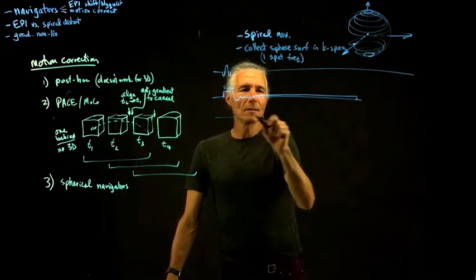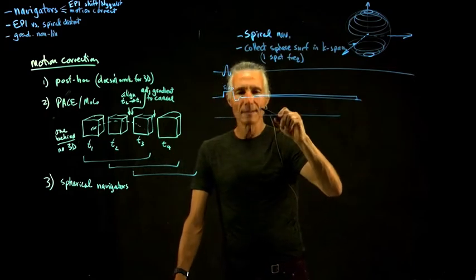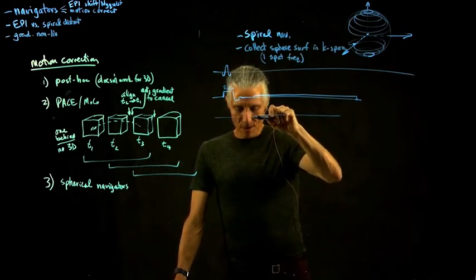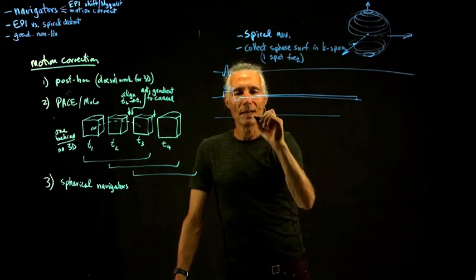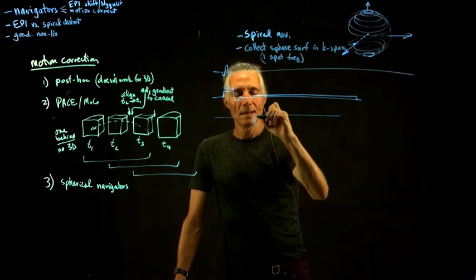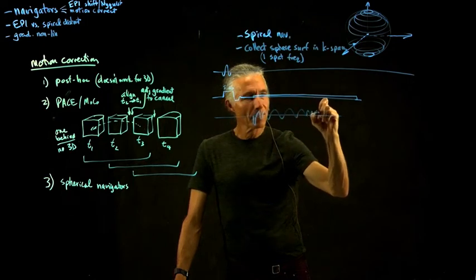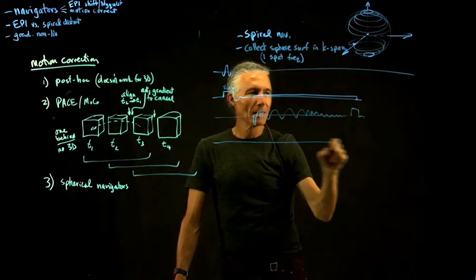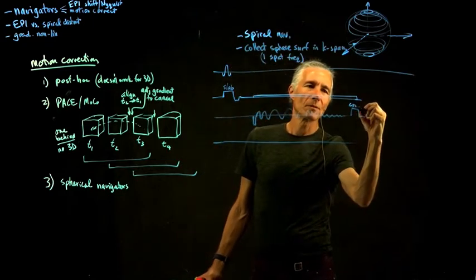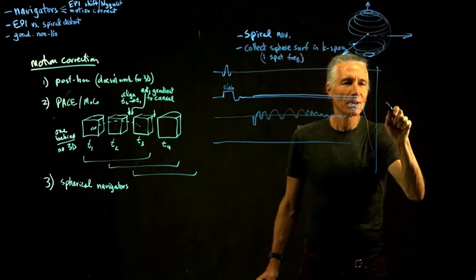And then what causes you to go around the sphere? That would be the spiral gradient. So while that's on, you might say, go to the bottom of K-space, and then do a spiral, and then maybe a crusher to get rid of any extra data, because we're about to collect real data here.